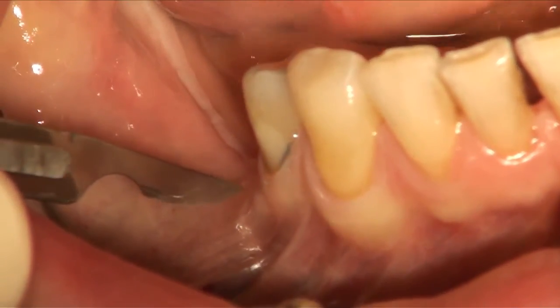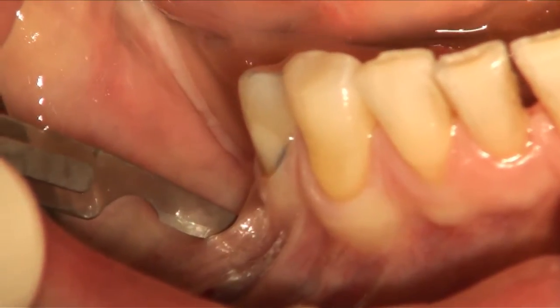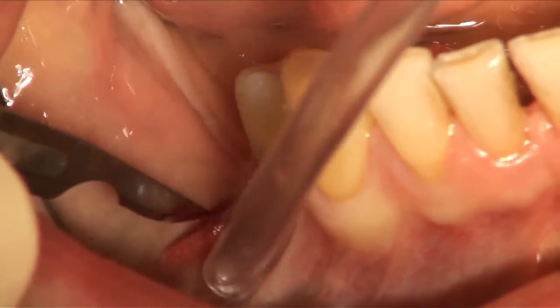We start with a vertical incision in the mucosa. And we do not cut the periosteum.